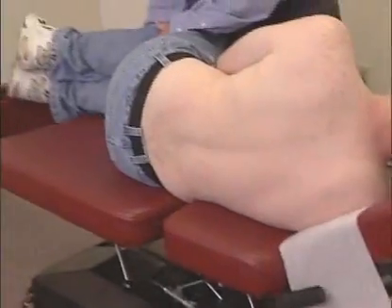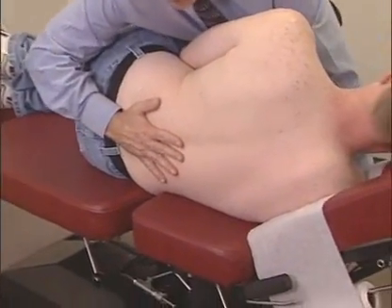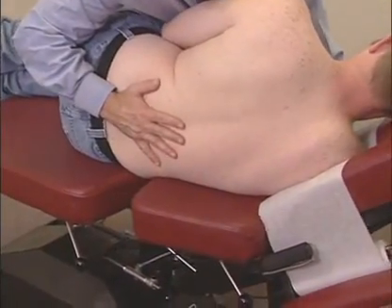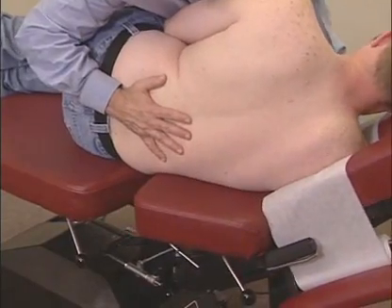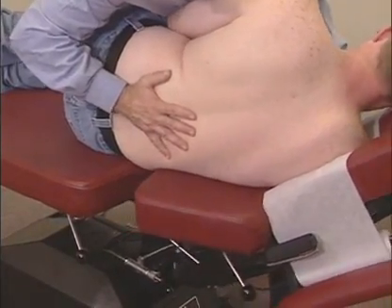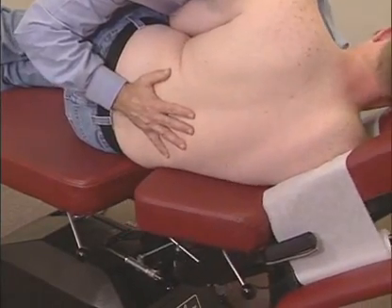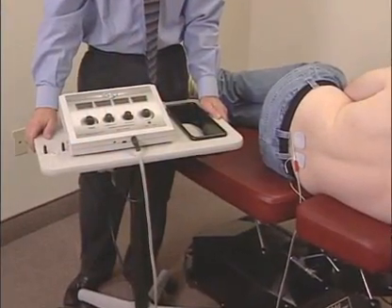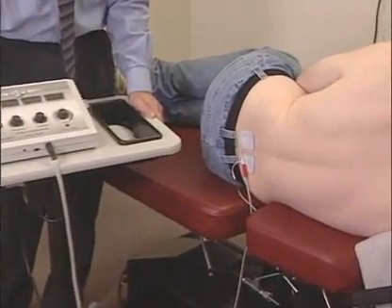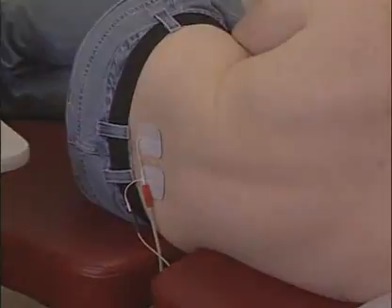Have the patient flex their knees another 25%. Slowly flex the tabletop back and forth 10 to 12 times. Again, stop if the patient feels any discomfort. This procedure decompresses the L5 disc, decreases facet joint stress, and increases joint motion. While the patient is in this side posture position, apply ice, appropriate therapeutic modalities, or light force adjusting techniques.